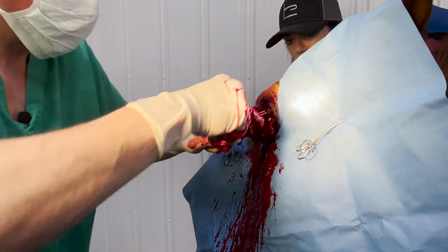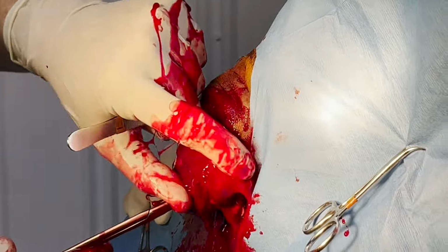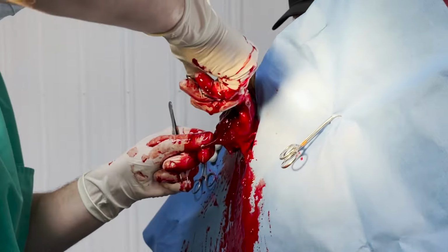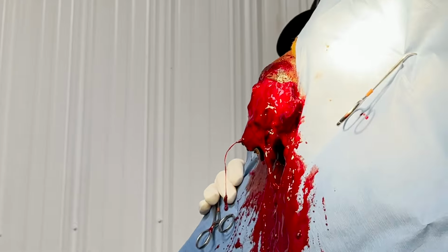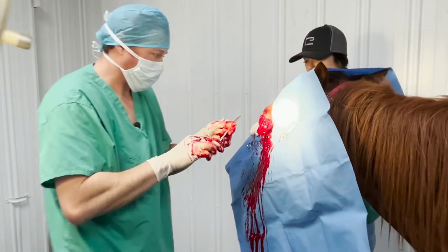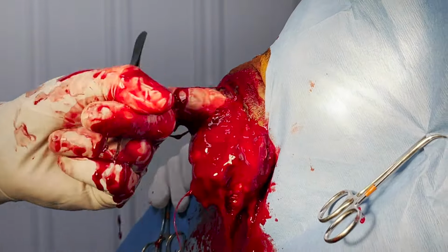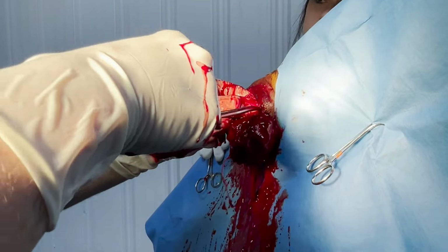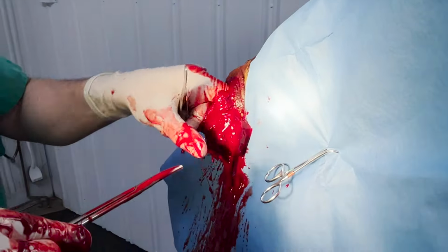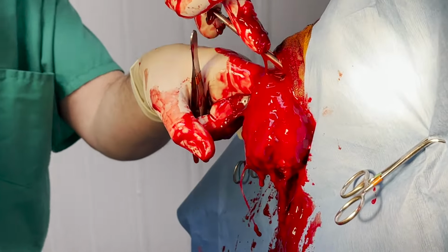Again, I'm using my suture tags as a handle. We've just about got this thing out of there. Need some bigger scissors. Almost done, darling. You can see the tip of those scissors are really curved, which helps you get back there. This big thick rubber band thing, the optic nerve, is just about to come out of there. Slightly smaller than my pinky. Just watch her. I'm getting ready to cut it. I'm going for the optic nerve here. I can feel it with my hand, and I get the scissors to it.